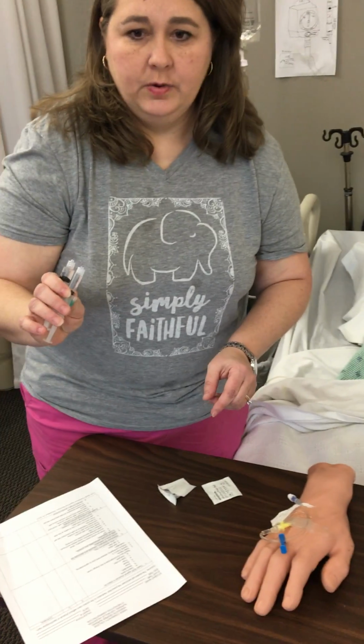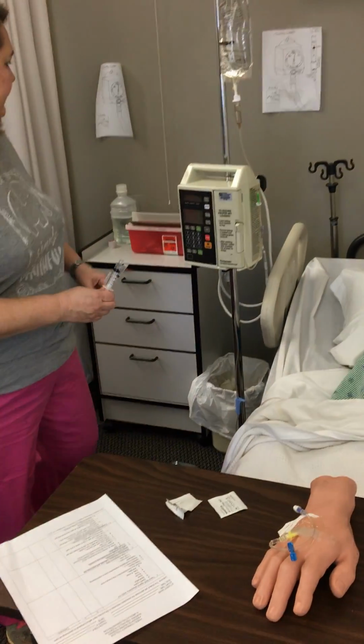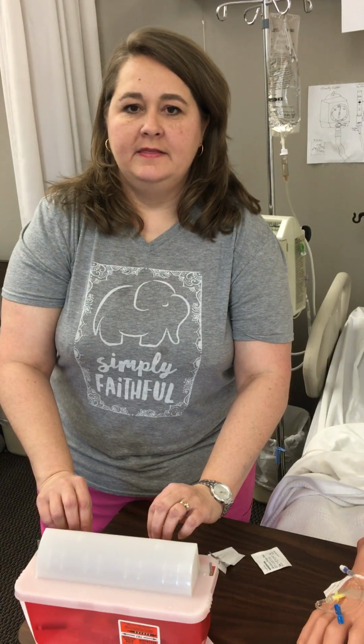These syringes will need to go into the sharps container, and I have one behind me here. Drop your syringes in your sharps container, and then of course wash your hands and then document.